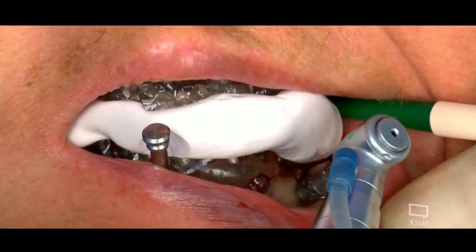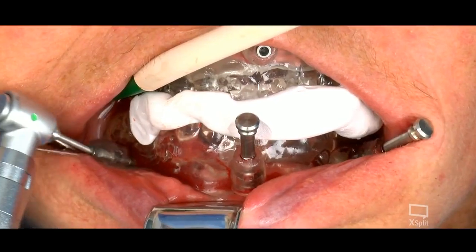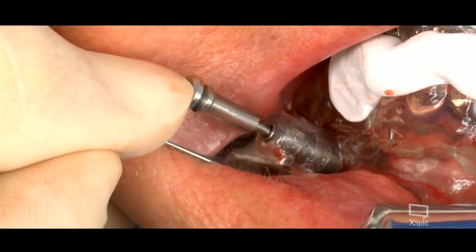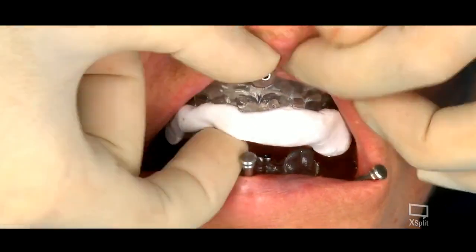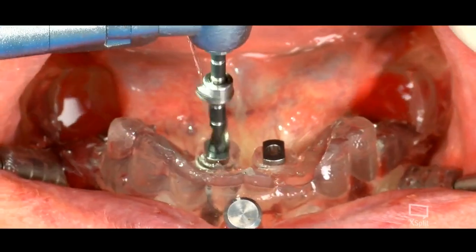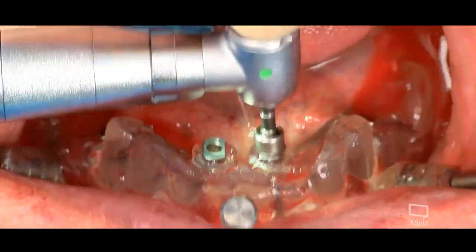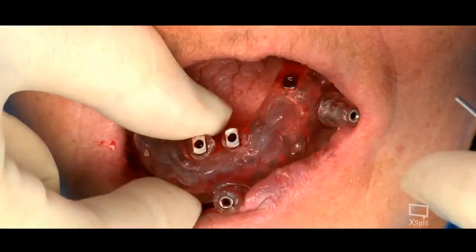This is the drilling of the pin holes, lower and upper. I don't know if I mentioned to you, but this case was not a fully guided case, it was just partially guided. And here you see the doctor drill just the pilot holes into the bone, and then he removed the guide and opened the flap.